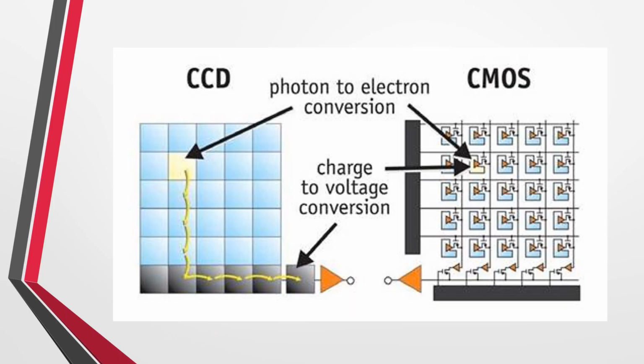Here's a quick look at each of the two technologies. We saw that the CCD, the charge coupled device, was very shiny, kind of glassy. This is a representation of that. The signal gets received here, it gets stored for a second, and it gets read out and amplified, like an op amp. In CMOS technology, each one has its own amplifier.